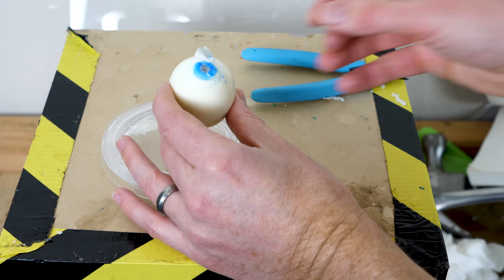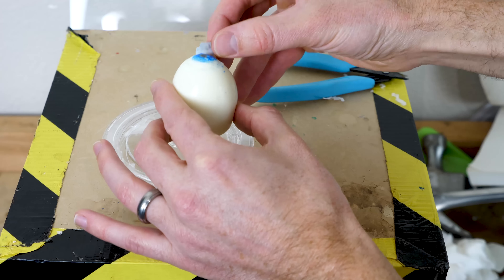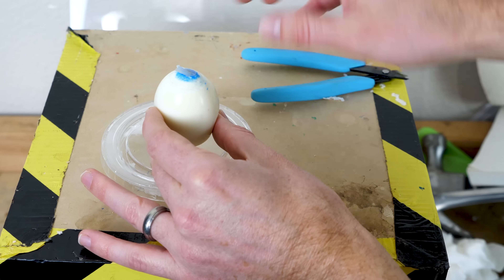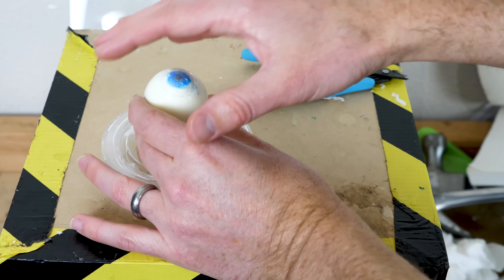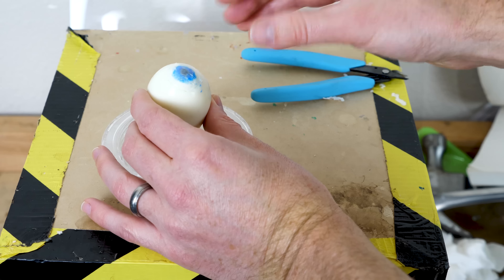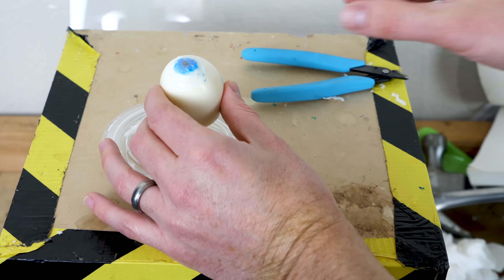That only takes a few seconds. Then the surgeon gently puts down the corneal flap and smooths it down. Your eye begins to heal on its own, and that flap will reseal within about six hours. The flap seals down and basically has a natural bandaid on it to start healing your eye.